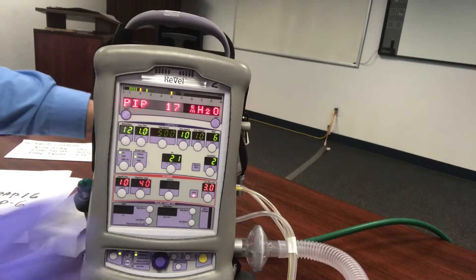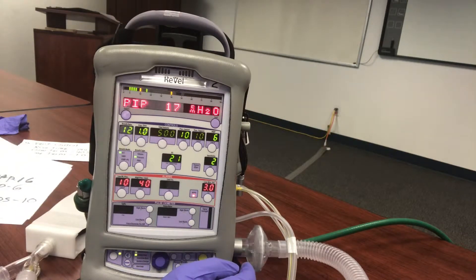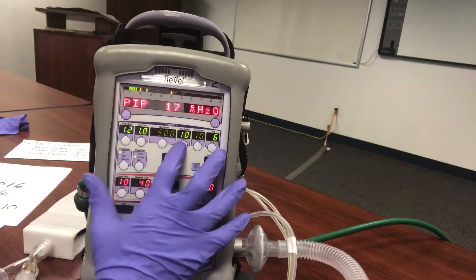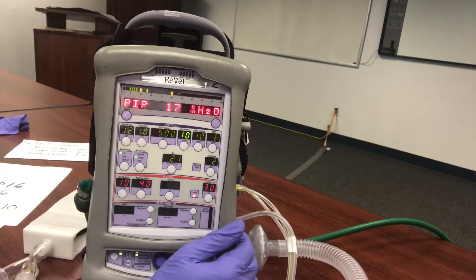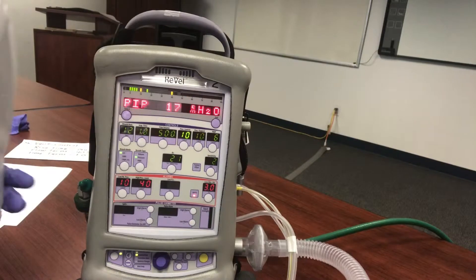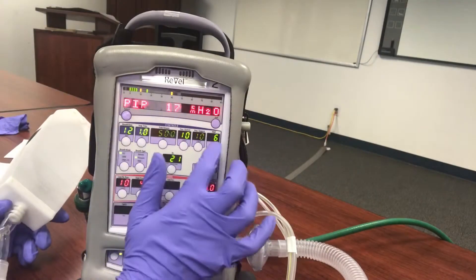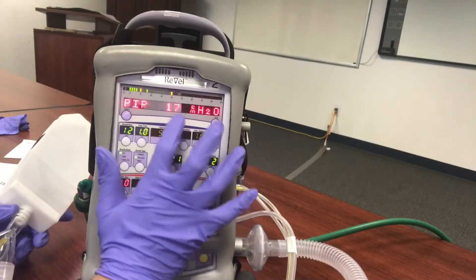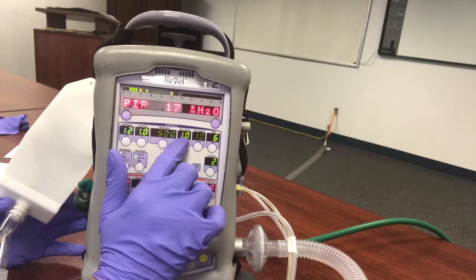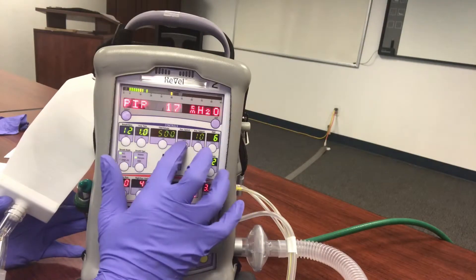Now that we have our patient on our BiPAP, remember when we set IPAP 16 over EPAP 6. When you're adjusting the ventilator now, you won't have an IPAP setting — it'll show Pressure Control instead. The math isn't perfect, so there's about 1 cm H₂O variation. Our setting is 16 over 6, and 16 minus 6 equals 10 — that's your pressure control value. So when adjusting, you're not adjusting IPAP directly; you adjust Pressure Control.